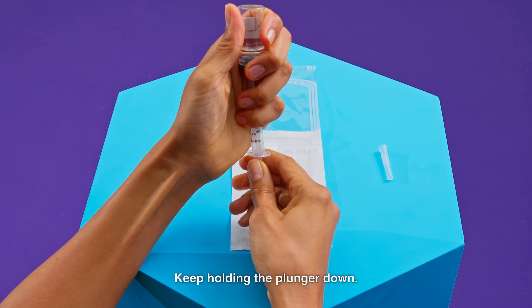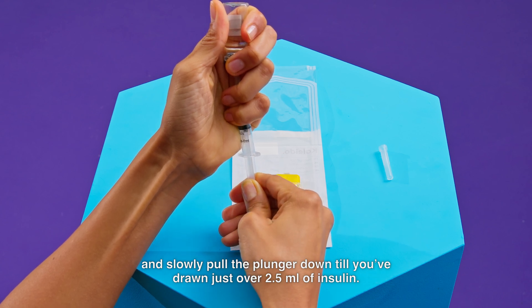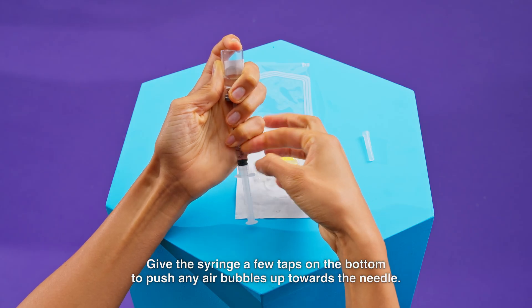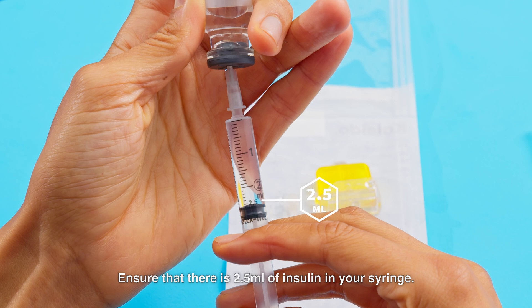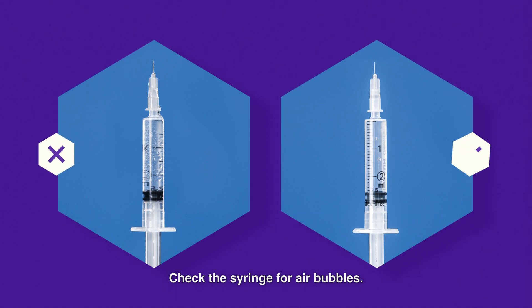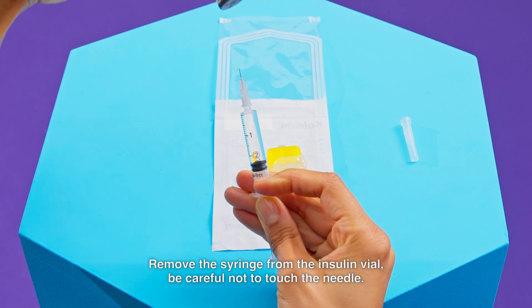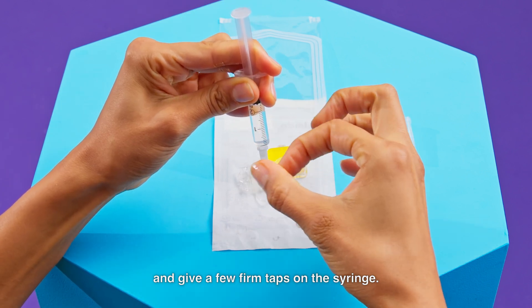Keep holding the plunger down. Turn the vial with the syringe upside down and slowly pull the plunger down until you've drawn just over 2.5ml of insulin. Give the syringe a few taps on the bottom to push any air bubbles up towards the needle. Push the plunger upwards to push the air bubbles back into the insulin vial. Ensure that there is 2.5ml of insulin in your syringe and check for air bubbles — some small champagne-sized air bubbles are acceptable. Remove the syringe from the insulin vial, being careful not to touch the needle. Turn the syringe so the needle is pointing downwards and give a few firm taps on the syringe.